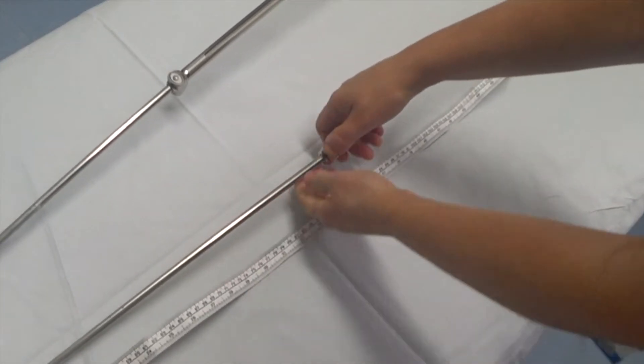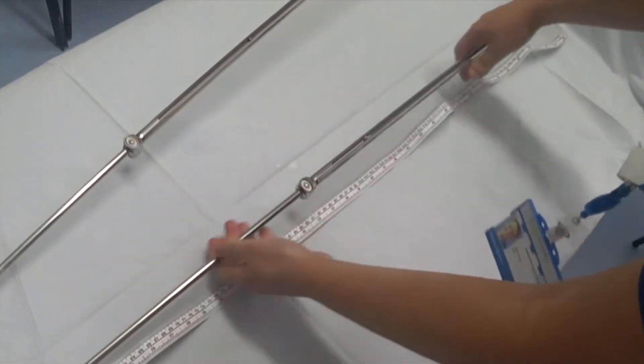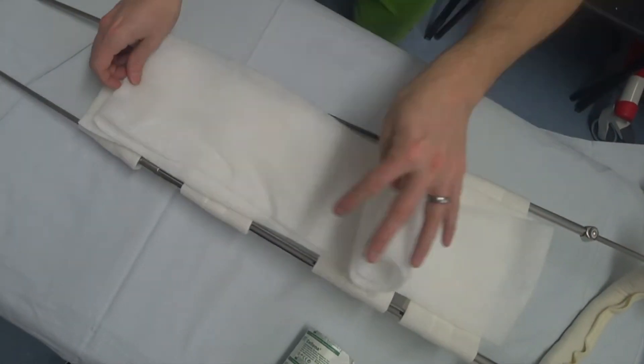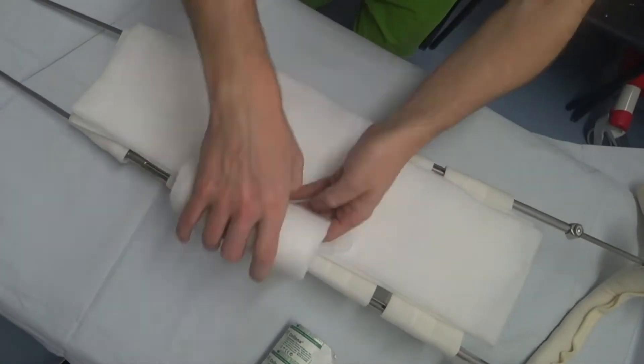To adjust the length, just press down on the buttons, moving the frame in or out to the desired length. Then place the velcro straps on the Thomas splint, ensuring that the lowest is 40cm or 16 inches from the bottom, so that the foot can be left free, and remember to fit the hoop pad. Then cover the slings in padding, creating a small pad for behind the knee.